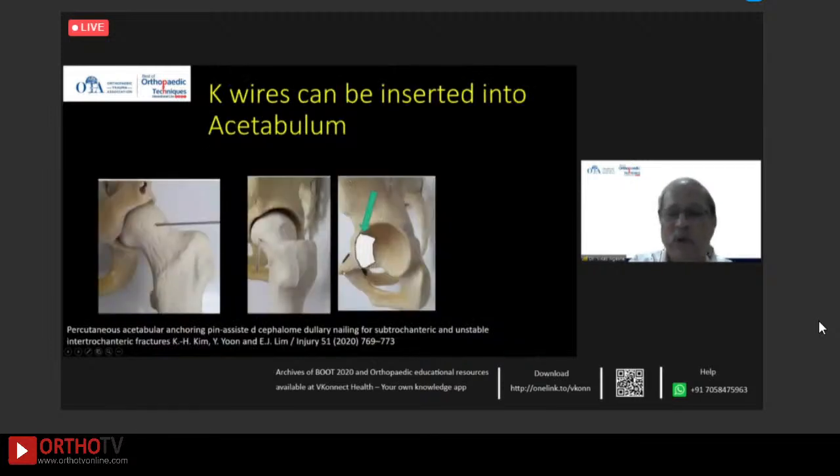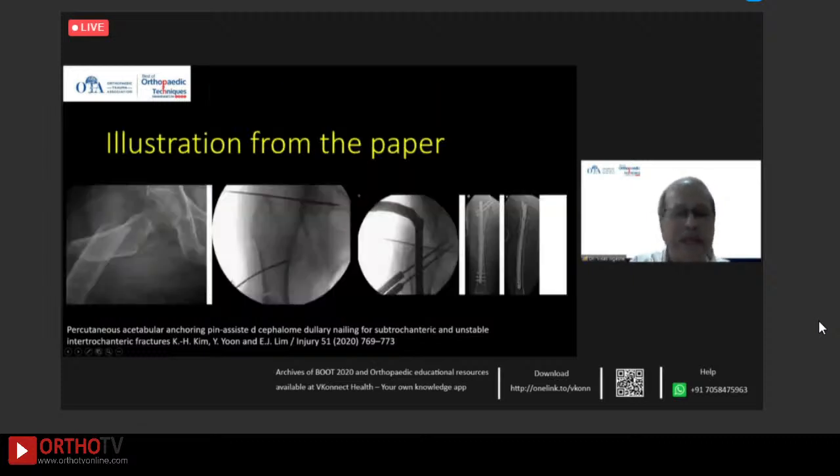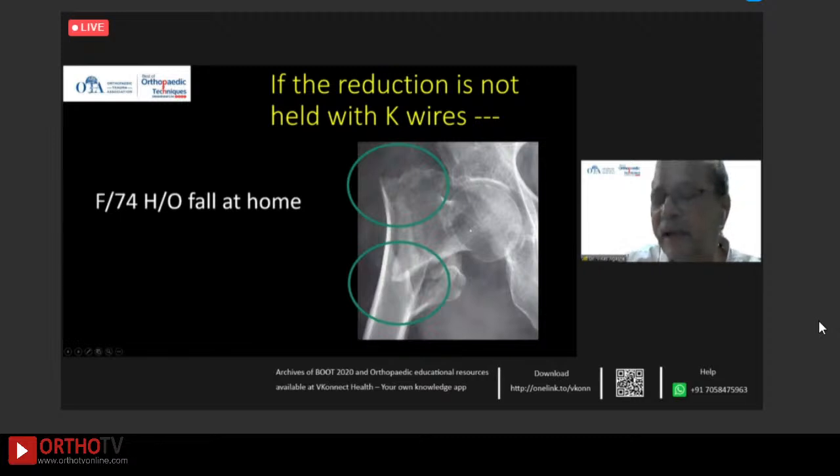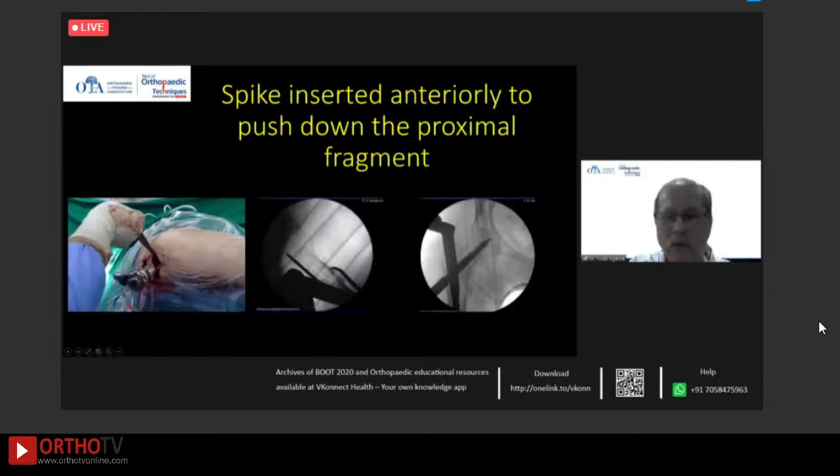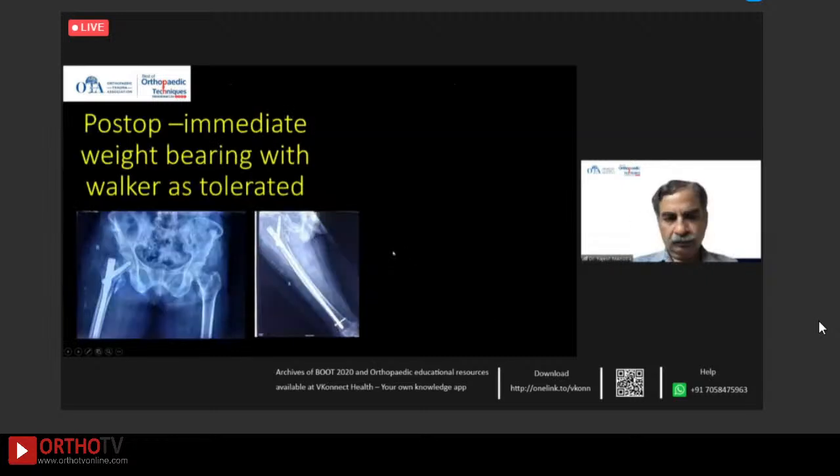A 2020 paper also describes putting it into the acetabulum. As you can see, the anterior K-wire is put into the acetabulum, especially in a grossly unstable fracture like this. You can put it into the acetabulum, and this is after putting a proximal femoral nail. But if the reduction is not held with K-wires, I made this mistake. You can see a markedly comminuted fracture, and after I put in a nail, I realized that the proximal fragment has gone way anterior. But it's not all that difficult. You put a spike and hold it and get a good anterior bone-to-bone contact. Proceed with the fixation. And this is post-op.